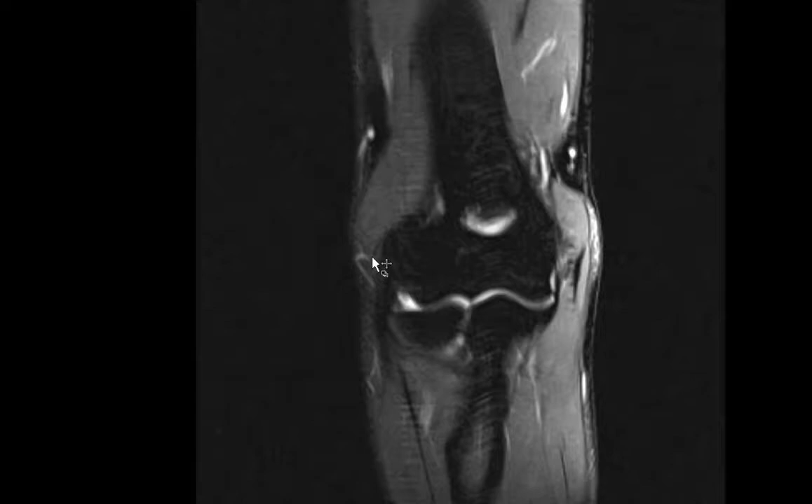On the lateral side you have the common extensor tendon inserting onto the lateral epicondyle, which is also nice and dark and hypointense. There's no thickening and no T2 hyperintense signal suggesting partial or full thickness tear. If there were tendinosis, thickening, intermediate signal, or partial tearing, that would be consistent with lateral epicondylitis or tennis elbow — but we don't see that here. The common extensor tendon gives rise to many muscles including the extensor carpi radialis longus, extensor carpi radialis brevis, and extensor carpi ulnaris.